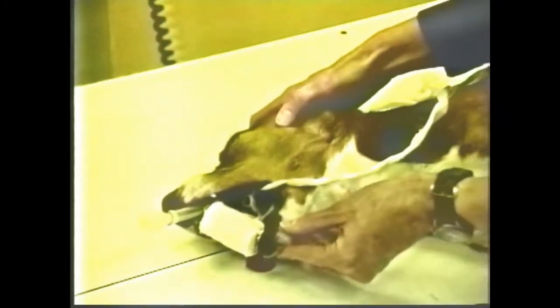You will notice that the nose is dropped and the mandible is not propped up as it was in the true lateral view. To see the opposite TM joint or tympanic bulla, the animal must be turned over and the film repeated using the same oblique positioning. The markers must be placed properly so as to identify the projected right and left sides of the anatomy.